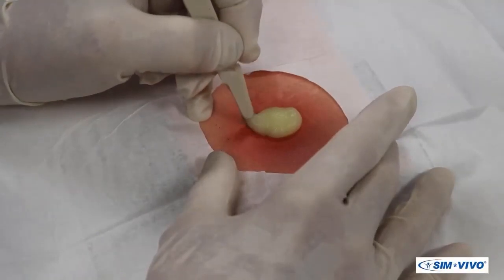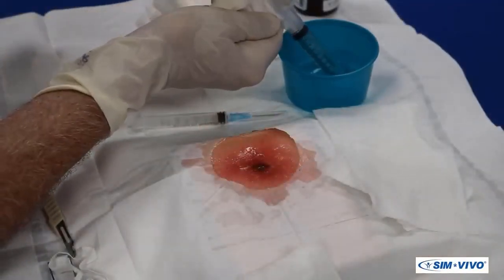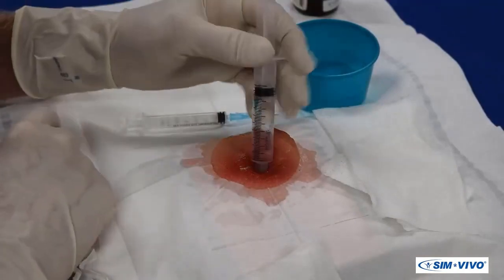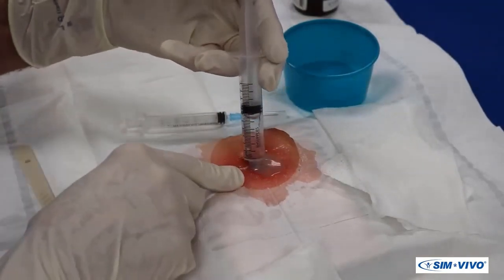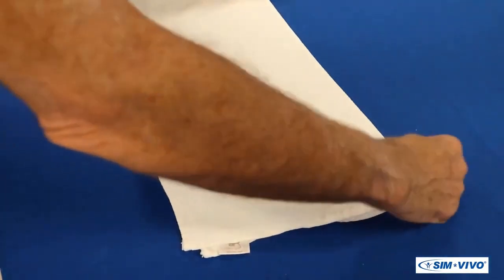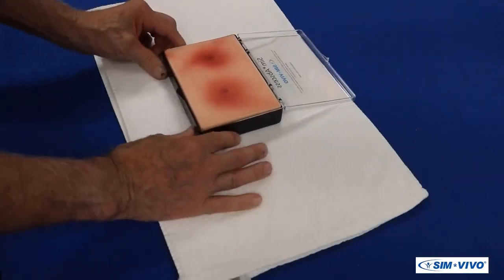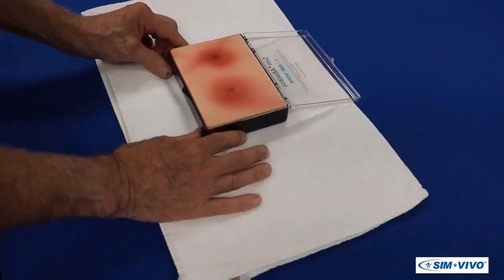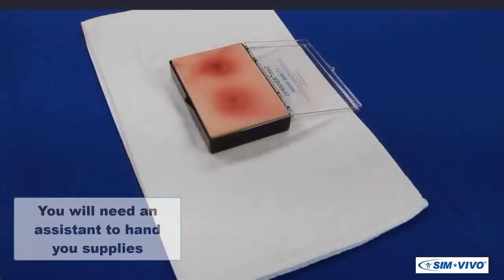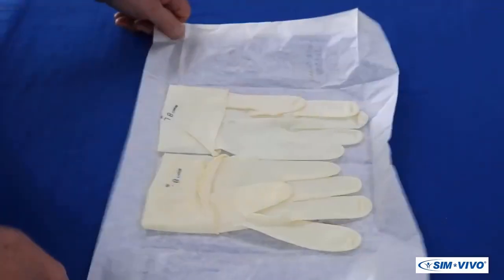Let's get started draining an abscess. Since complete evacuation of the purulent material from the incised abscess may require copious irrigation, we recommend placing a towel on the table. Open the sim abscess container and place it in a comfortable position in front of you. To complete the simulation of the sterile field preparation, you will need an associate to act as an assistant.